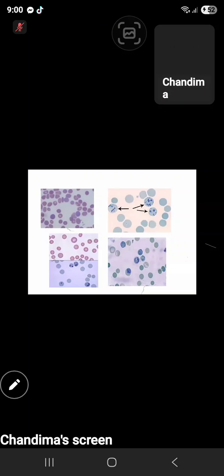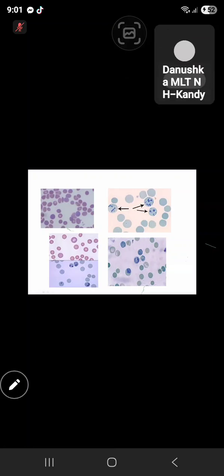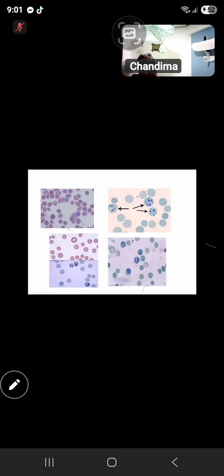Normally, in infants and children, NRBCs and reticulocytes can be clearly differentiated. NRBCs have nucleated cells, but reticulocytes do not have a nucleus. They only have remnants, which stain with new methylene blue. In Leishman stain, they appear as polychromatic cells.